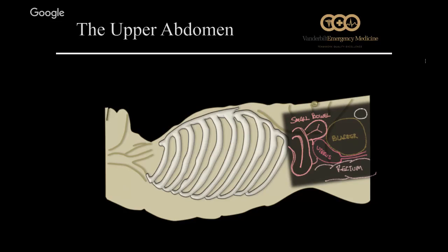So like I said, probe marker is going to be midline, just above the pubic symphysis, probe marker up towards the head. You can see in the little cartoon, the pubic symphysis is the white circle. We're going to scan through the bladder, and we're going to identify the vaginal stripe just below the bladder, contiguous with the cervix and the uterus.